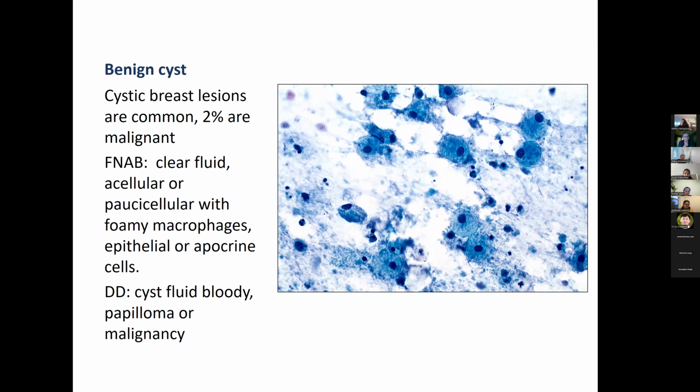So here, some of the most common indications I find these days is getting a cyst aspirated, and this is mostly very benign appearing, and the majority of the cyst fluids are benign, and a few, like less than 2%, can be malignant. But we still get these specimens.